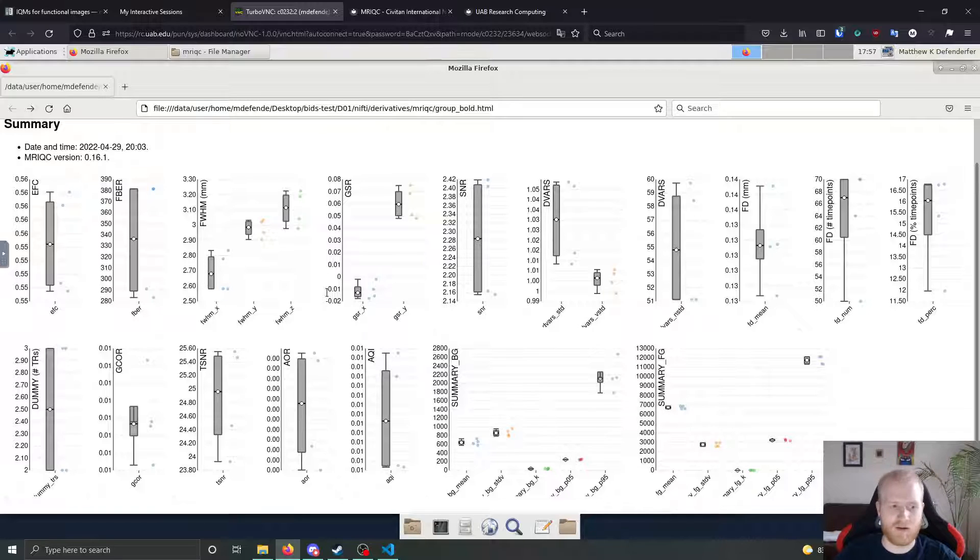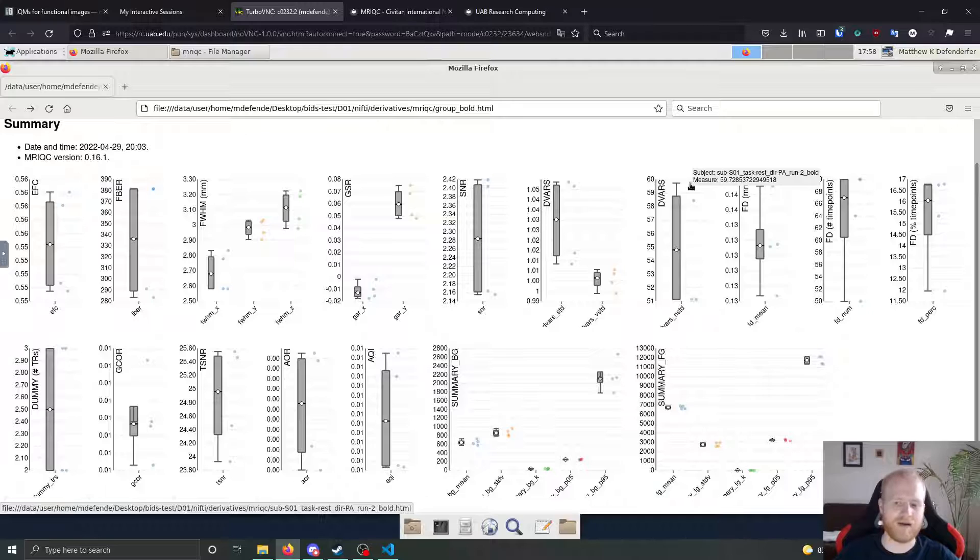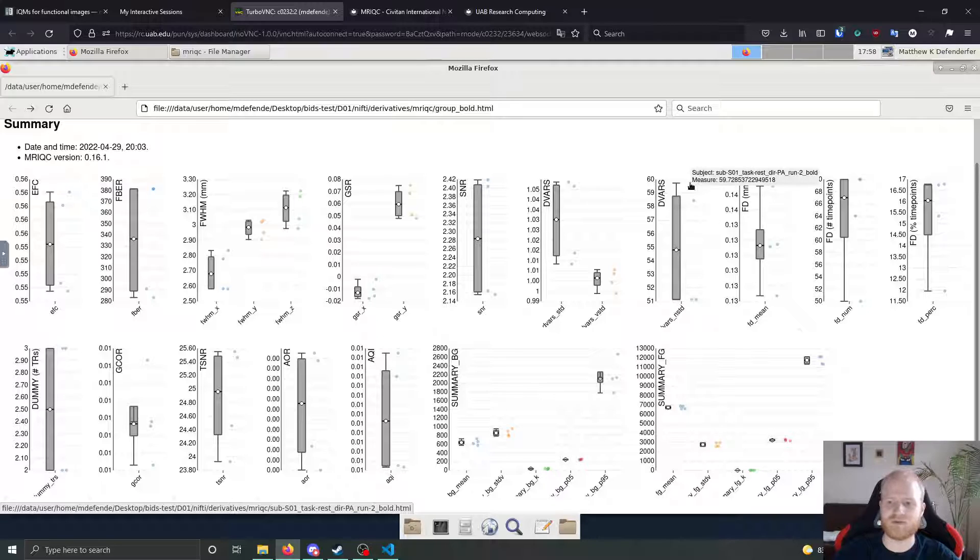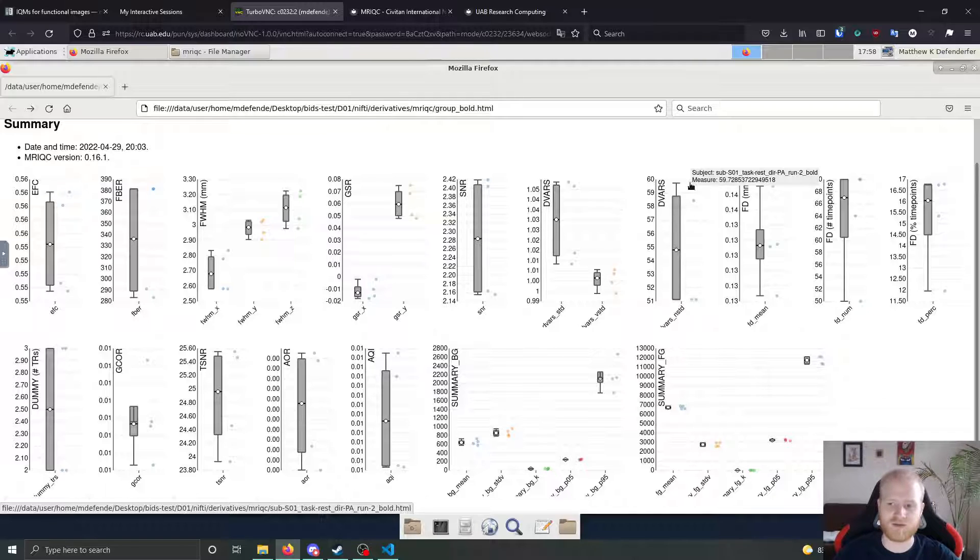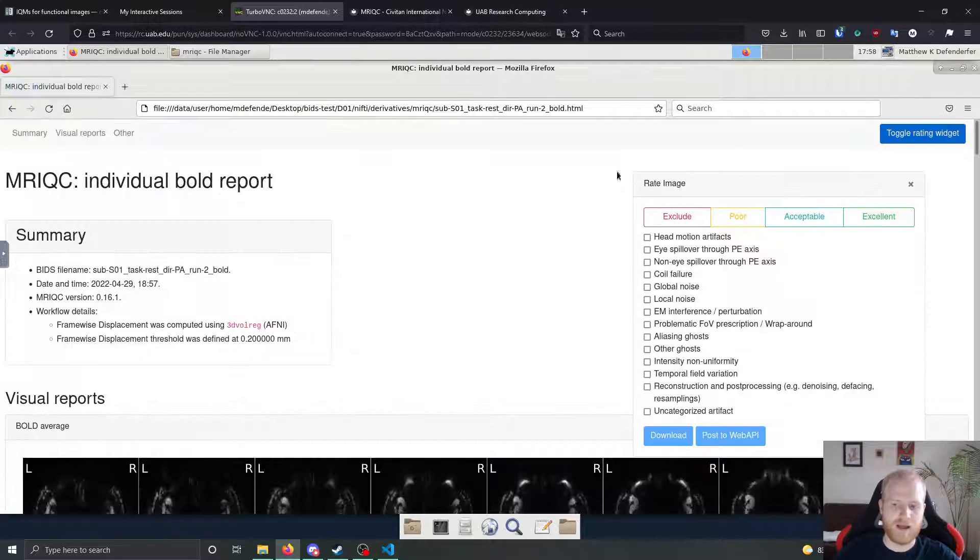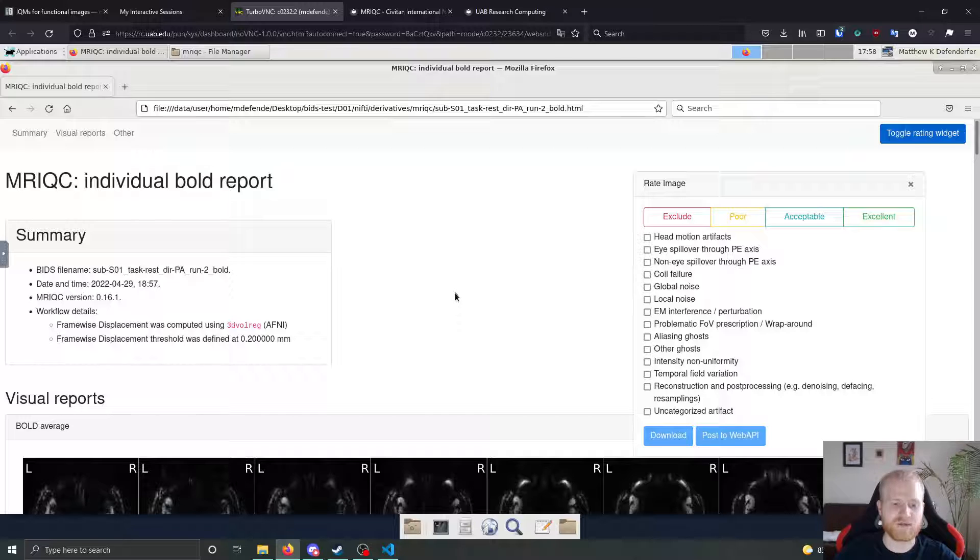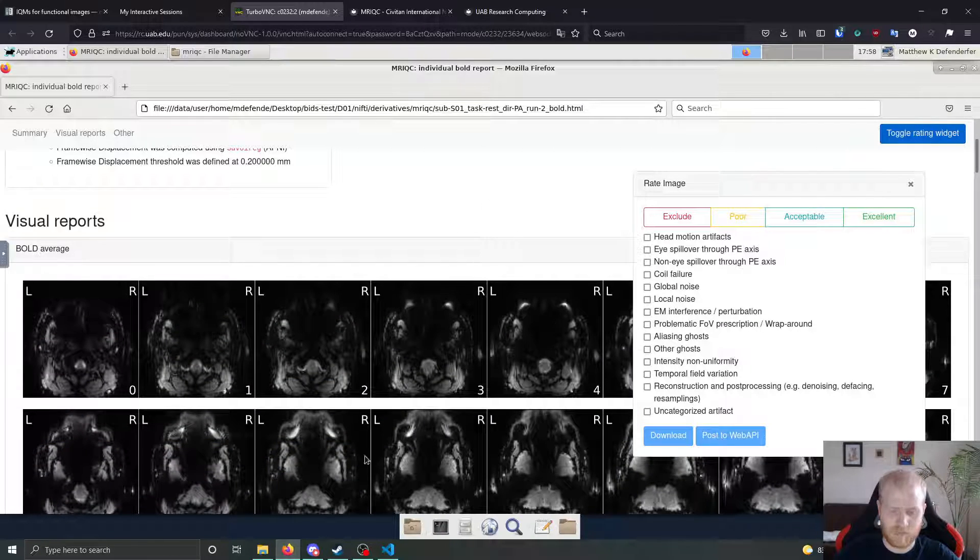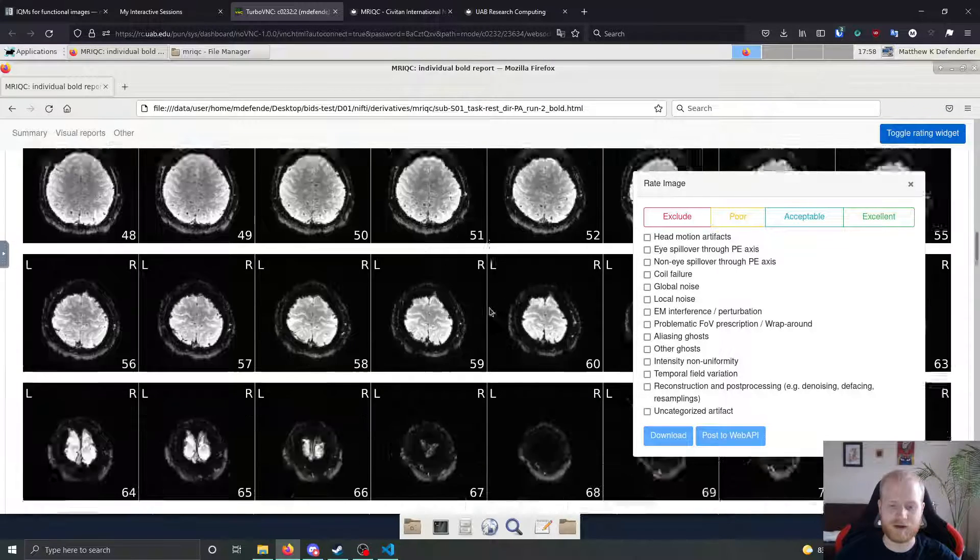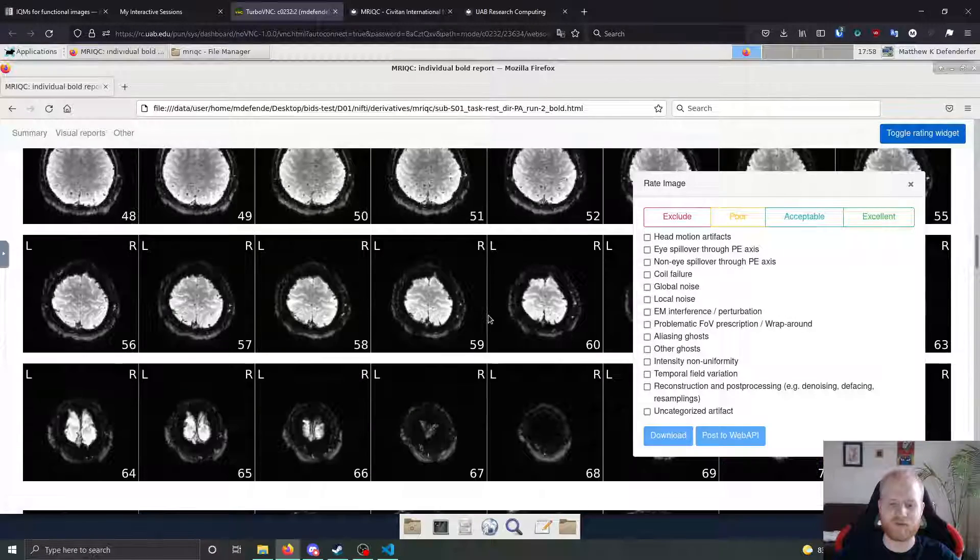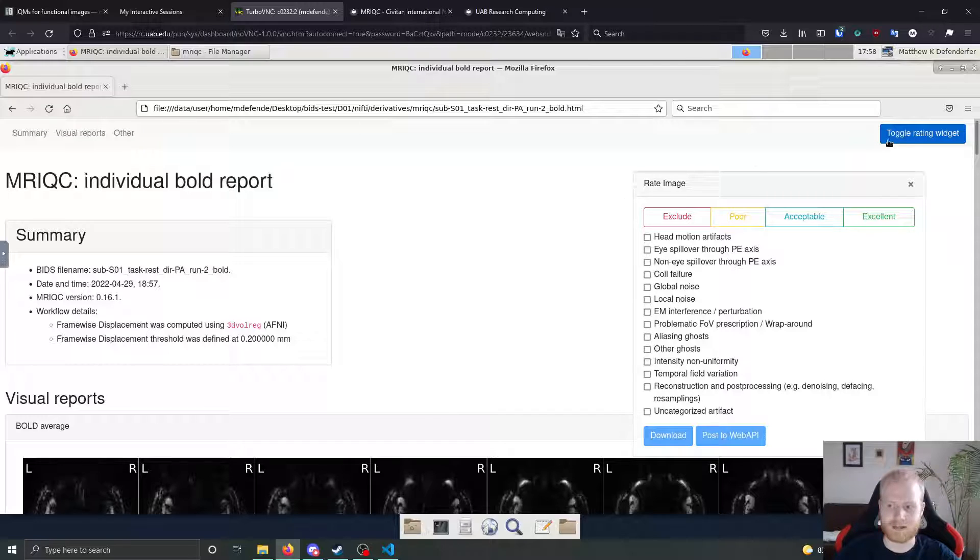If you're looking through the data and you see one that's an extreme outlier in our case, since we only have four data points, it's hard to find an extreme outlier, but say this one right here was an extreme outlier. Whenever you had data for a huge number of subjects available, you can click on this data point here. So first of all, it comes up with the name of the scan that the number comes from, but you can then click on that data point and it'll take you to the HTML file that that data point comes from. So if this was an outlier in terms of DVARs, then you could read through this file here and figure out what might be wrong or just look at it for further analysis.